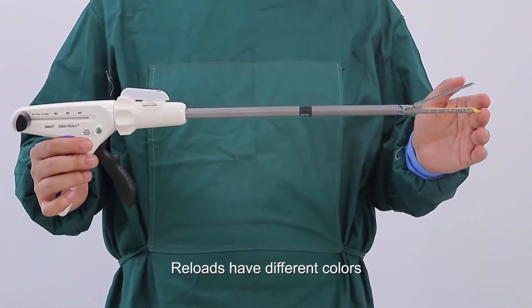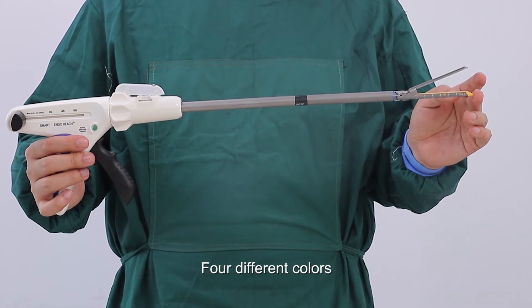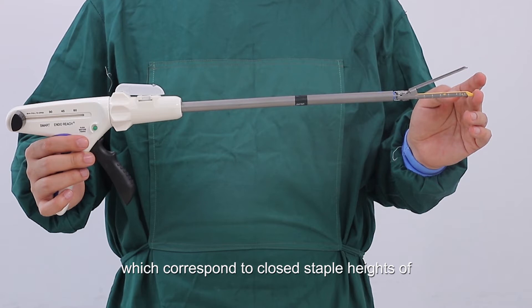Reloads have different colors. We have white, blue, gold, and green — four different colors which correspond to closed staple heights of 1.0 millimeters, 1.5 millimeters, 1.75 millimeters, and 2.0 millimeters.